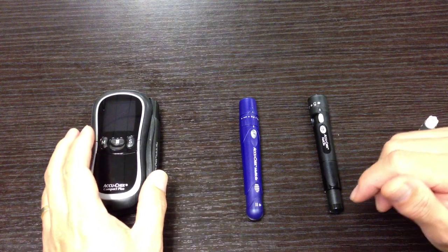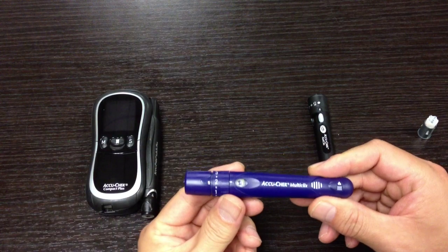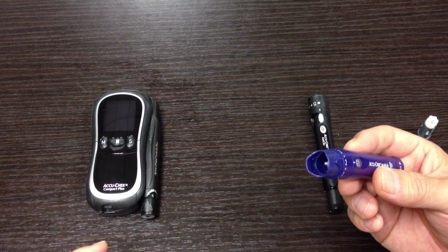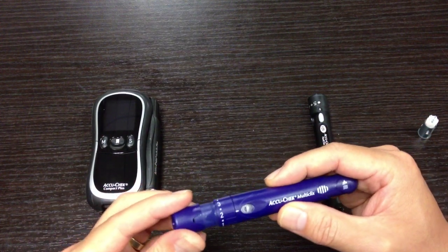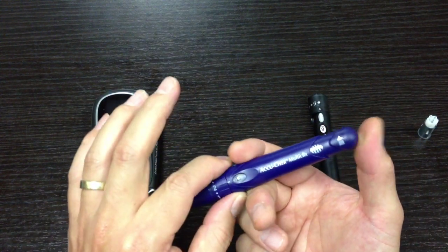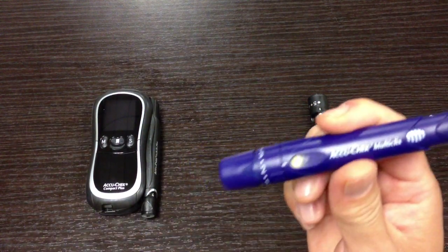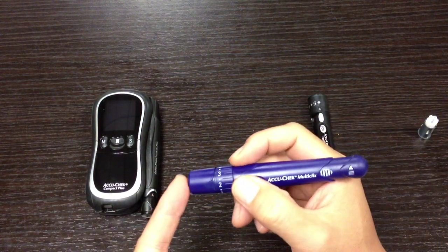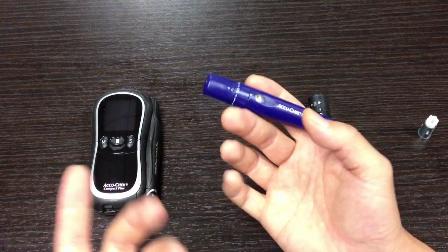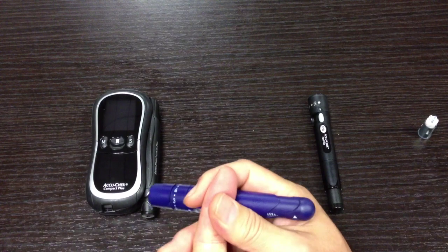Let me show you the old AccuCheck Multiclick — that's what it looks like. You just take the cap off, put the drum in there, and once the drum is in, you press down on the back of the lancet device to engage it. You can see a yellow indicator comes up. Once you press it, you put your finger there and press it, and it would poke you so that you could get some blood.